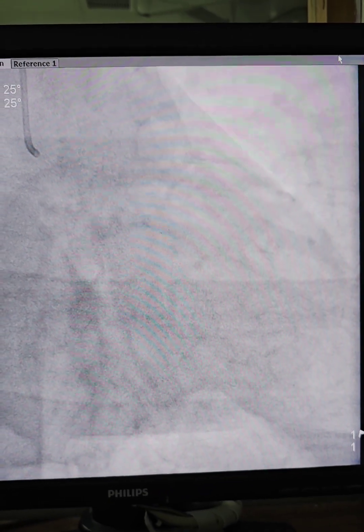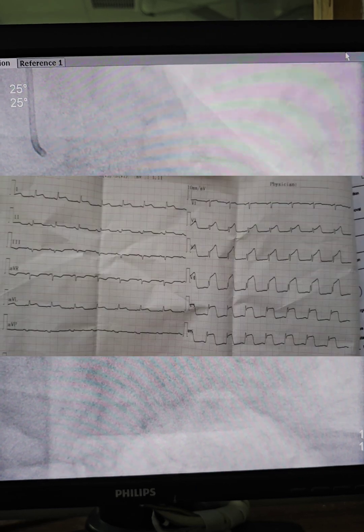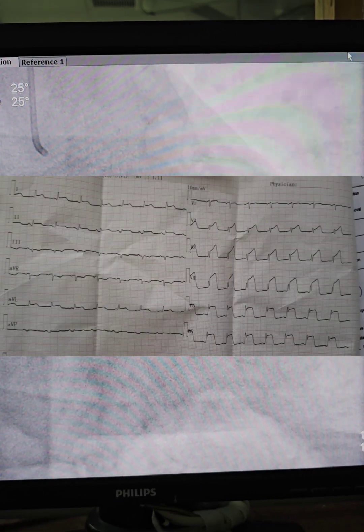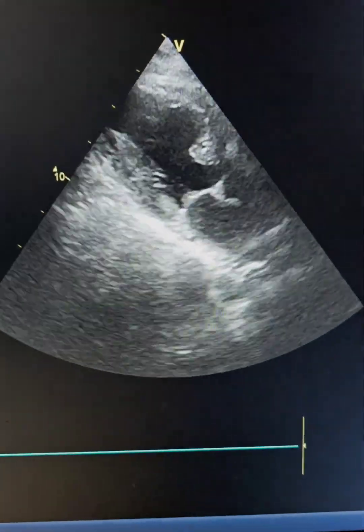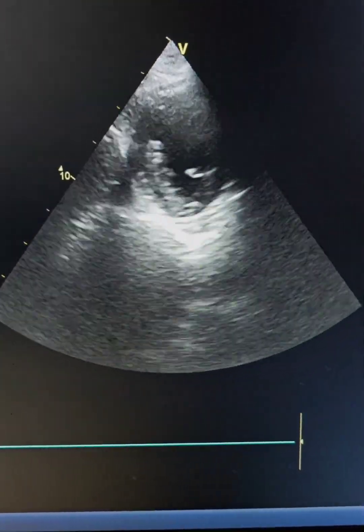Here we discuss a 46-year-old gentleman, smoker as a risk factor, with chest pain for almost 6 hours. ECG showing extensive anterior MI, 2D echo showing severe LV dysfunction with LAD territory hypokinesia. So we took the patient for emergency angiogram.